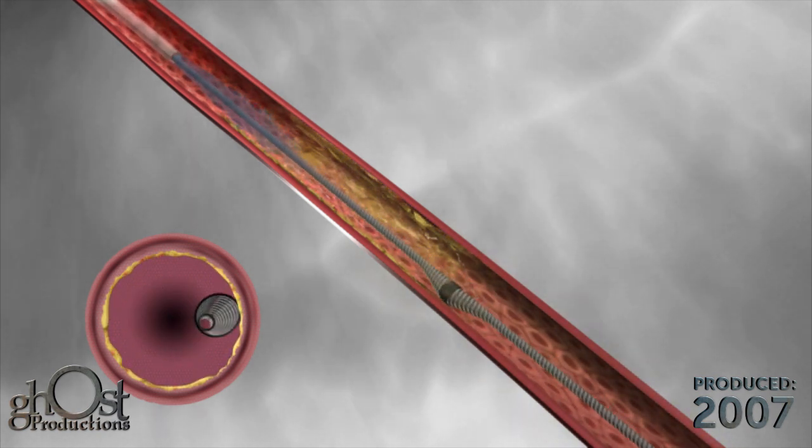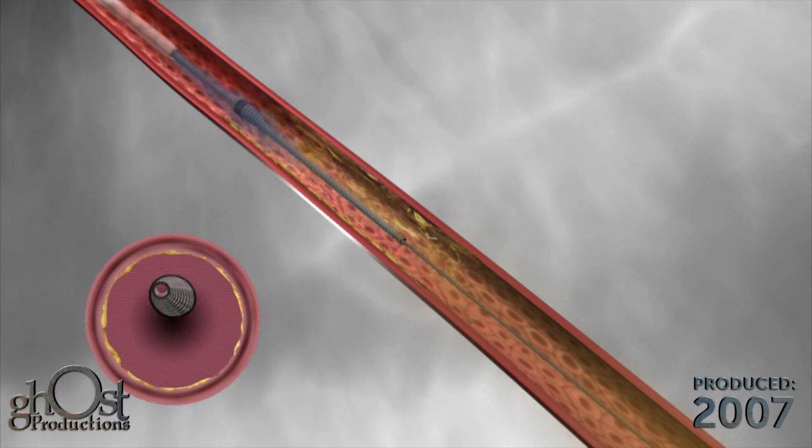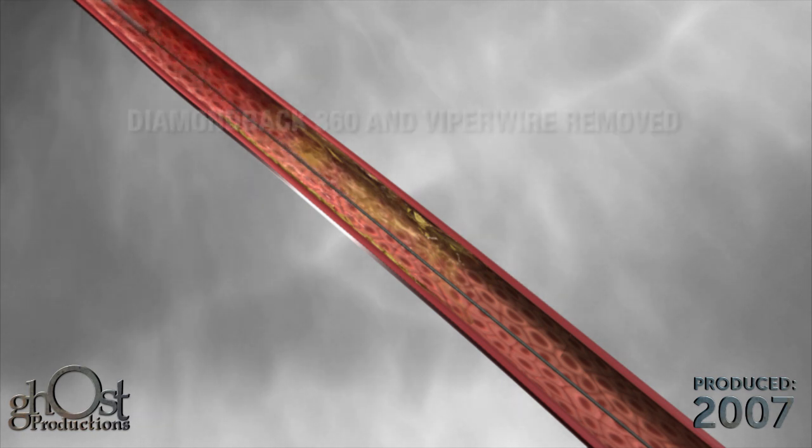A final angiography is performed. The Diamondback 360 and Viper wire are then removed.